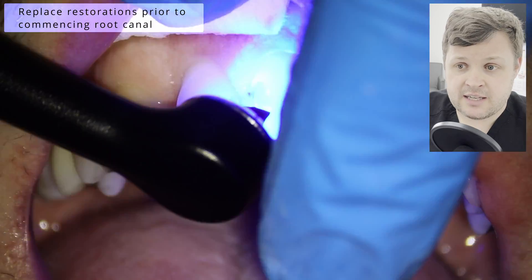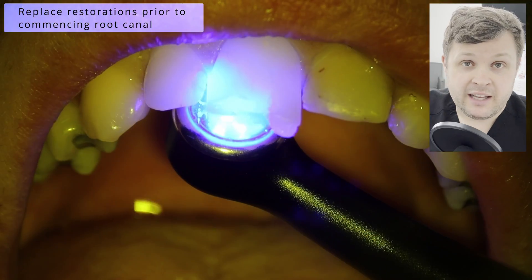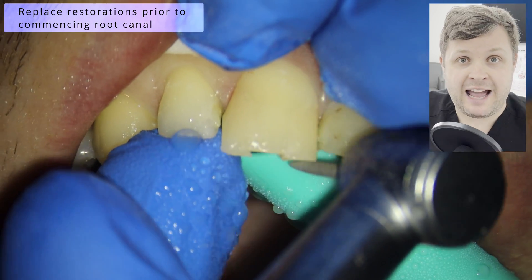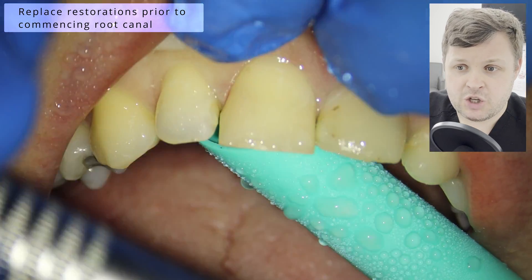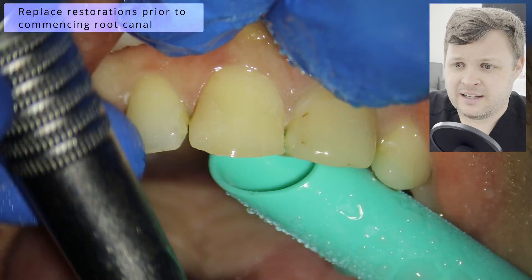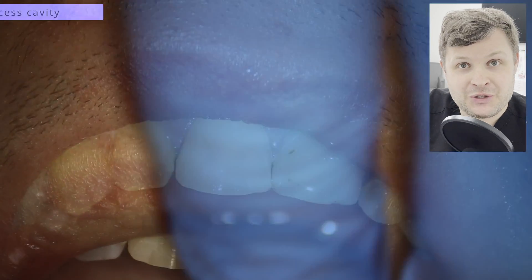Just a few seconds ago we removed the composite filling, and the distal aspect of the ledge inside had quite a large overhang. It was in the tooth's best interest to remove that overhang because it could fracture really easily. What I like to do is throw the composite in, overfill it, then shape it afterwards — you've got a little more control that way. Now I'm just using a white stone to polish the tooth up and it looks really nice — all the stains are gone.